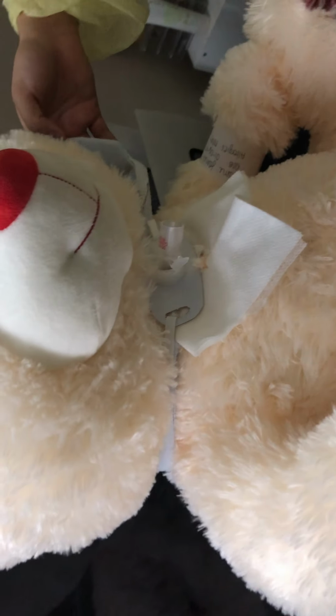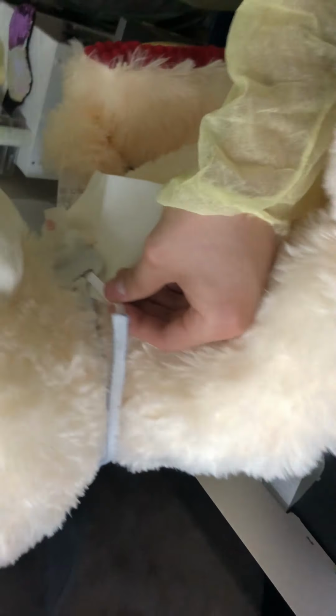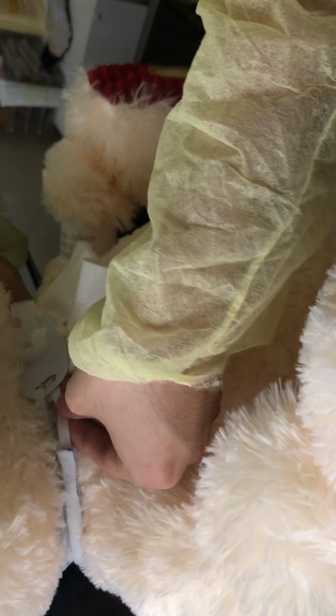Alright, Mr. Brown, go ahead and go forward. Wrap it around his neck. Of course, I would be super careful. Make sure I leave two finger width length as free space to not provide any damage.